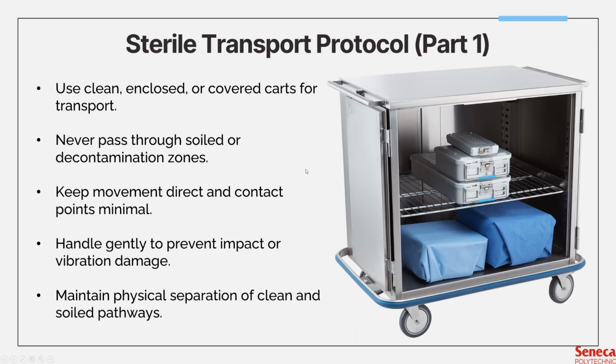And then sterile transport protocols, part one. Transport of sterile items must always protect the barrier system from damage or contamination. For that reason, you have to use clean, enclosed, or covered carts dedicated to sterile transport only. You never push sterile containers through soiled or decontamination zones. That is a big no.